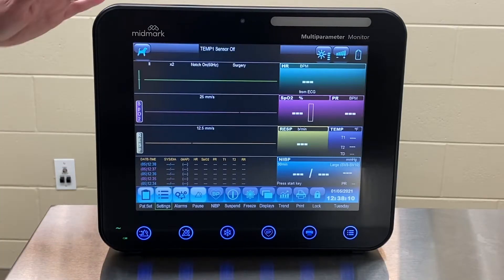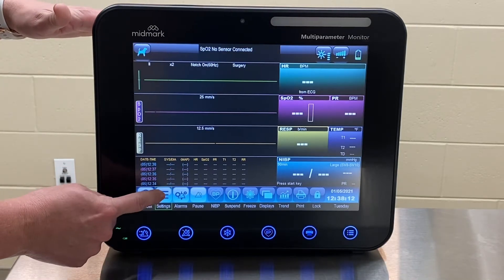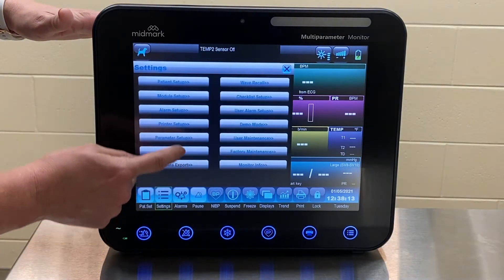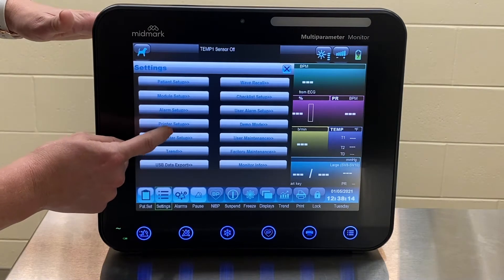To customize printer settings, press Settings and select Printer Setup.